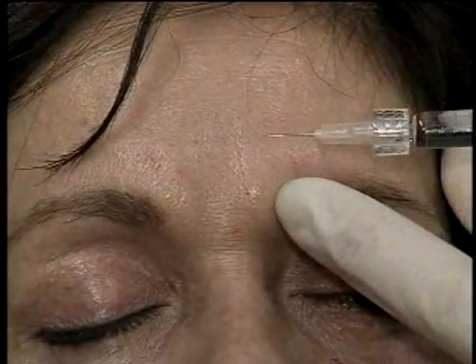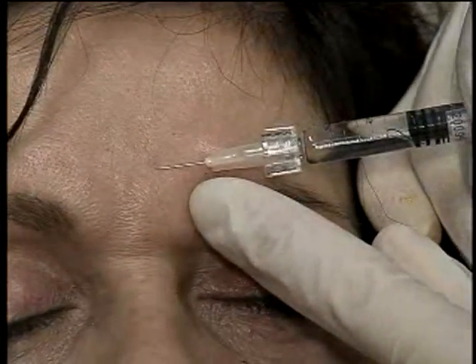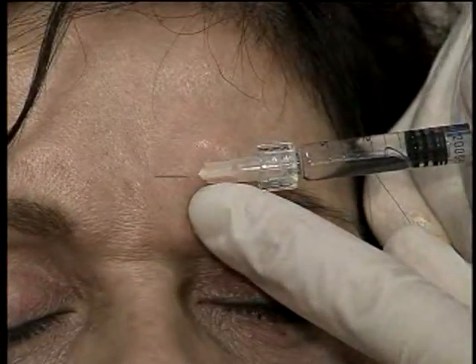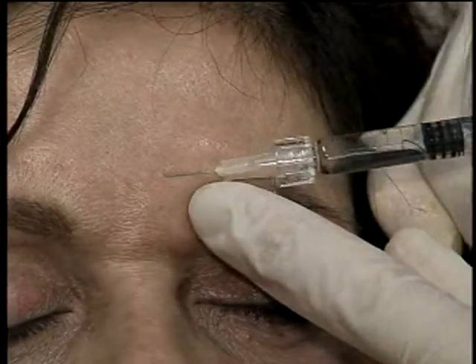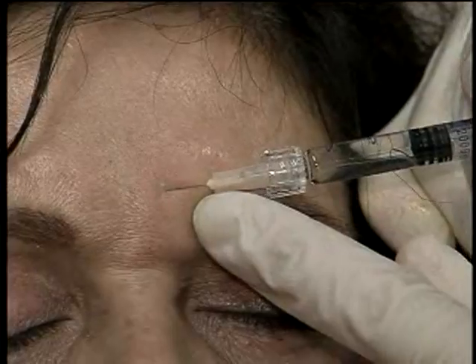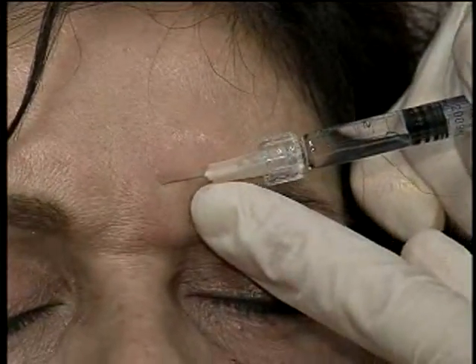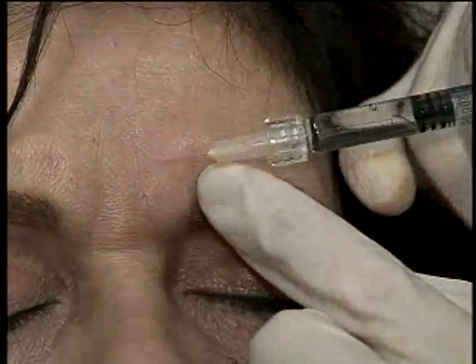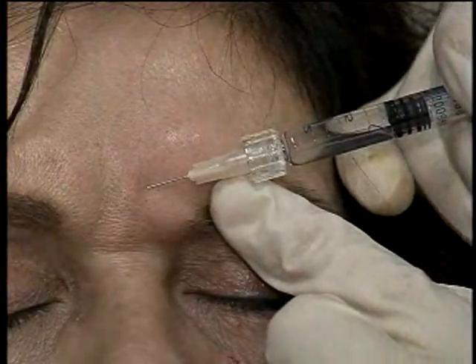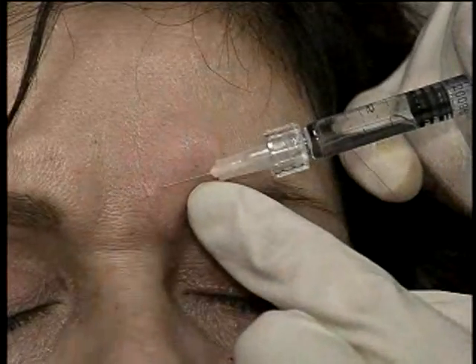So when I have them frown, relax, and I will go just into the dermis. And here I'm really truly in the deep dermis. And I inject into the crease. And this is the serial droplet method we had talked about earlier, where I just put little droplets. I like to go transverse to the crease and slow. And I think this gives me the best results.